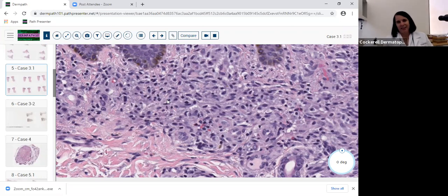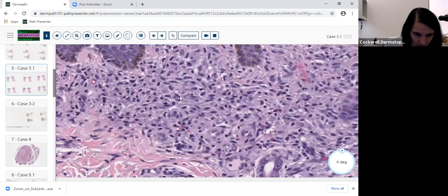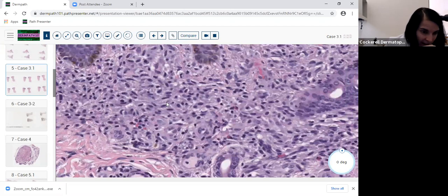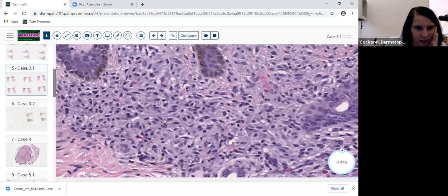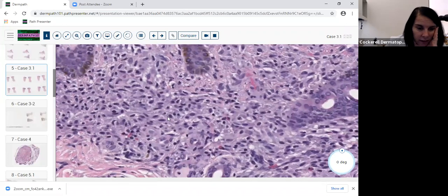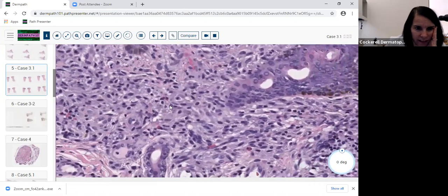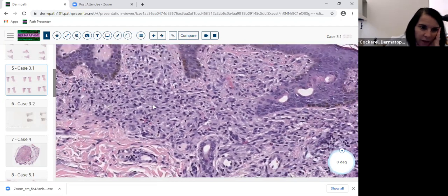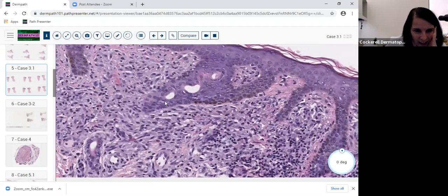And that these are somewhat spindled is subjective too. They're ovoid to spindled. Some of them are more spindled, more cigar shaped, and others are more oval, and others are out and out round. But they all seem to be the same cell type. So right away you're thinking, well, could these be histiocytes? Well, maybe this is an eosinophilic granuloma. Oh, wait, I see eos. Is it? No, but these nuclei don't look reniform. Is this lymphomatoid papulosis? No, I don't see those really bizarre multinucleated cells here.